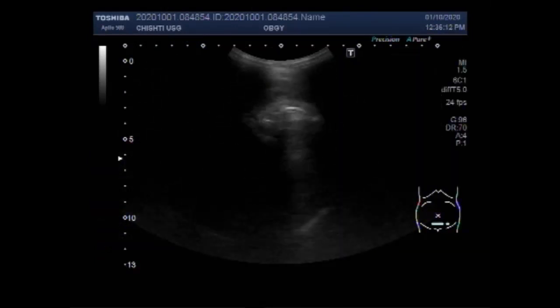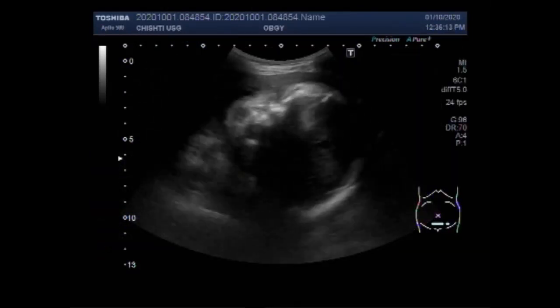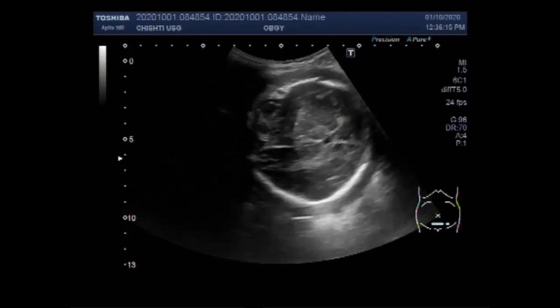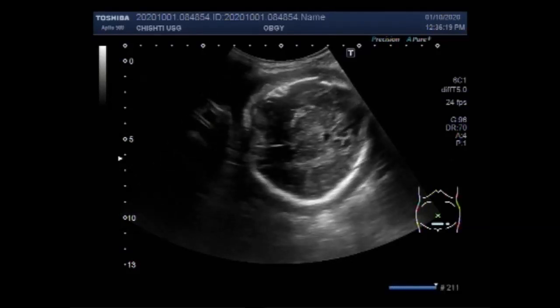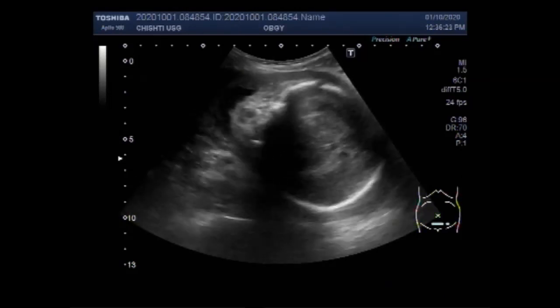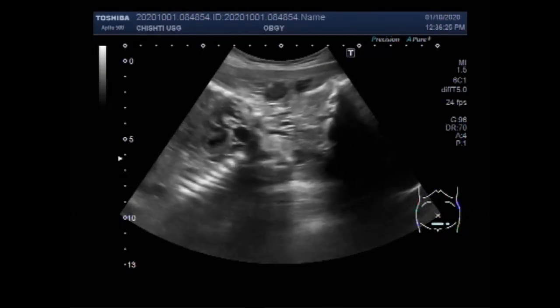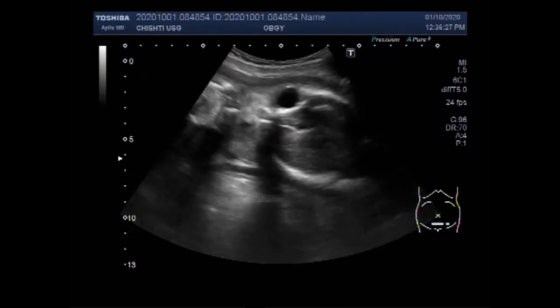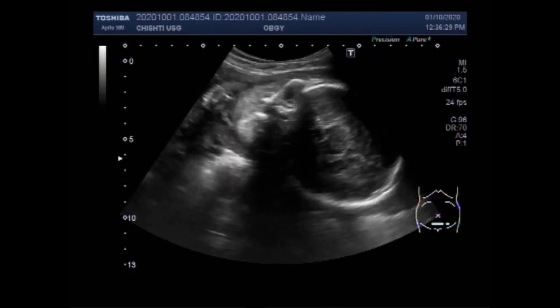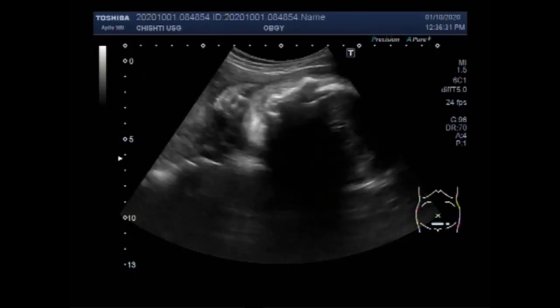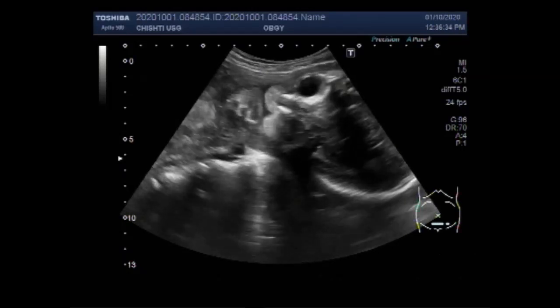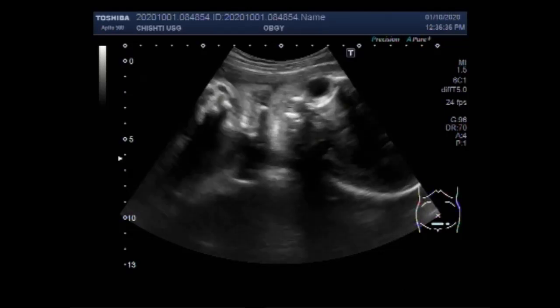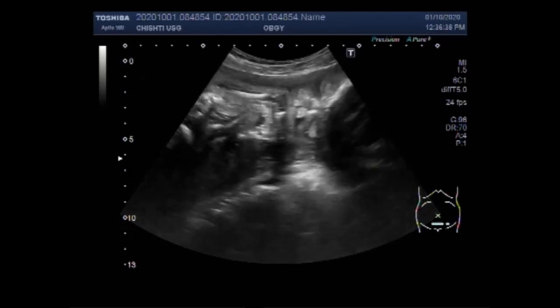Oligohydramnios refers to amniotic fluid levels that are less than expected for gestational age. It is typically diagnosed by ultrasound examination and may be described qualitatively — for example, reduced amniotic fluid volume — or quantitatively, for example, amniotic fluid index equal to or less than 5 centimeters, with single deepest pocket less than 2 centimeters.